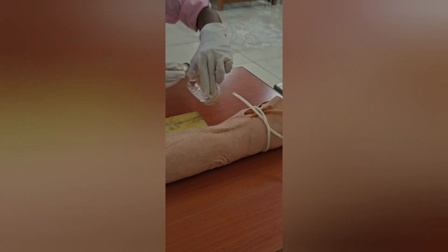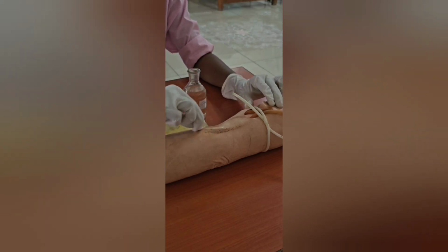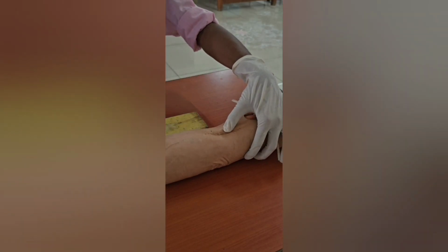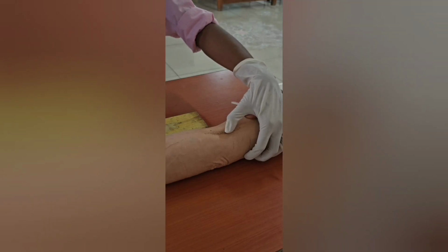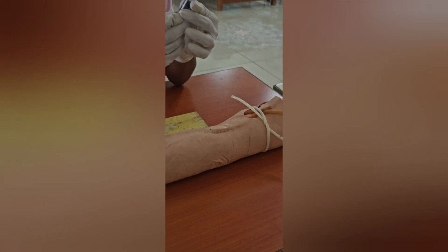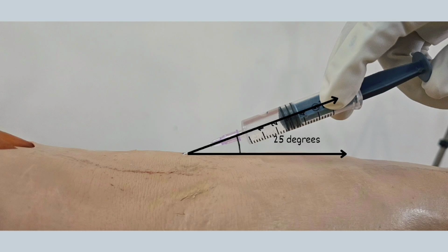Once that is done, disinfect the skin with alcohol wipes. Then, stabilize the vein by pulling the skin taut in longitudinal direction by the other hand. Then choose the appropriate syringe and load it with the required amount of drug to be administered. Insert the needle at an angle of 25 degrees. Puncture the skin and move the needle into the vein.